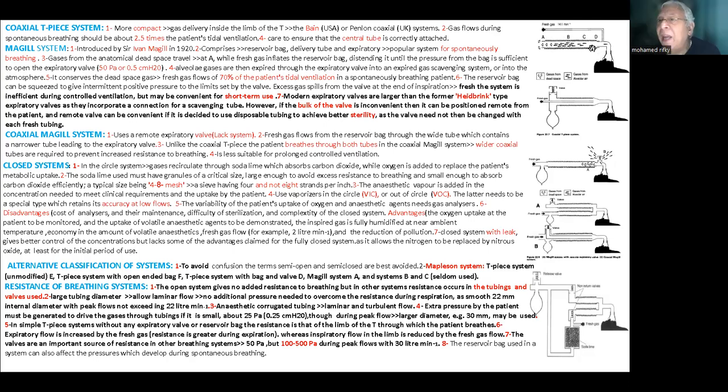So if we have enough expiratory pause, most of this expiration will be expelled before, and no dilution of the inspiratory gas will occur. But if we have no pause, the patient may take some of his flow from this area of D, where it contains some of the expired gas, especially in peak flow.